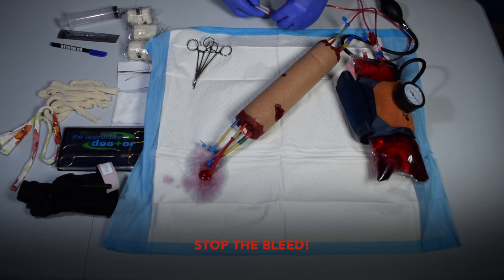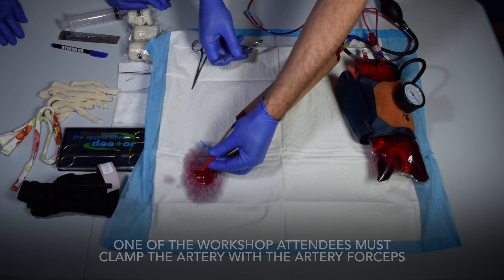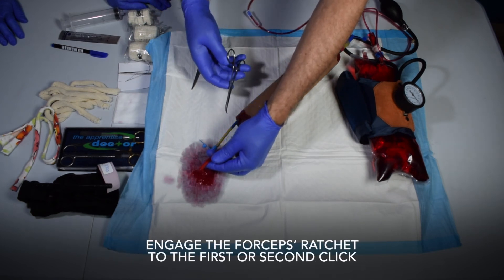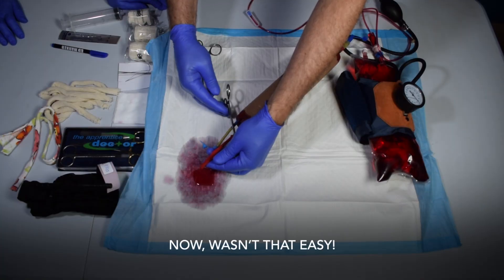Stop the bleed! One of the workshop attendees must clamp the artery with the artery forceps. Engage the forceps ratchet to the first or second click. Check for residual bleeding. Now, wasn't that easy?